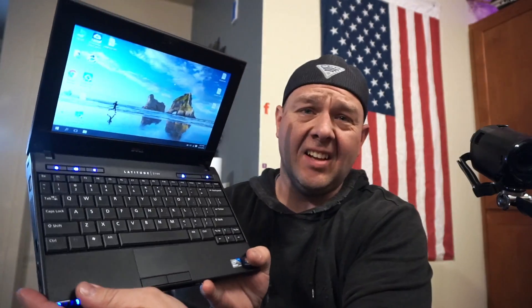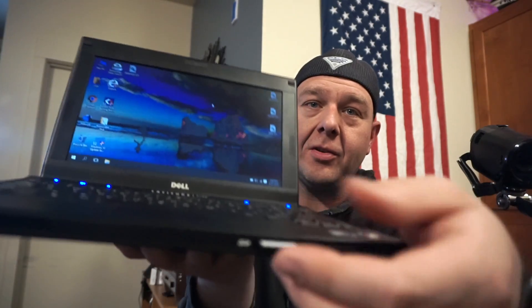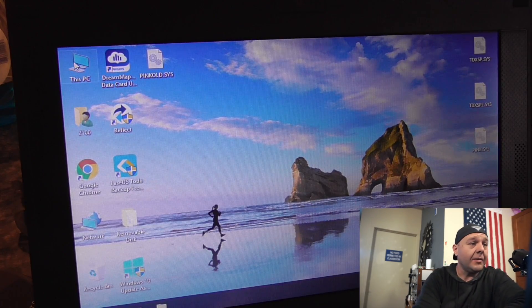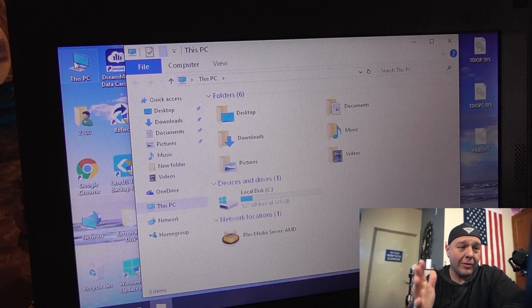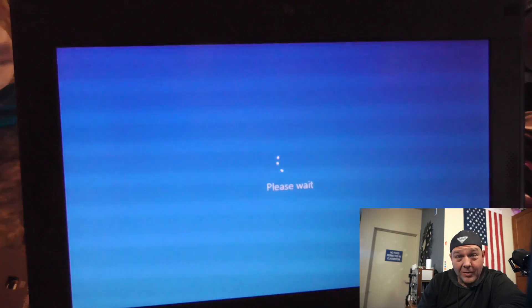This particular computer I'm using is pretty old — it's like a Dell Latitude 2100. But the reason I like this one is it has an SD card slot on the front, so you can just stick your card right in there and you don't need any adapters or accessories at all. After the card is in the computer, go ahead and open up 'This PC' — I'm running Windows 10 — basically open whatever is going to show you all the drives on your computer. This thing decided to do some updates, so we're waiting for that to finish.